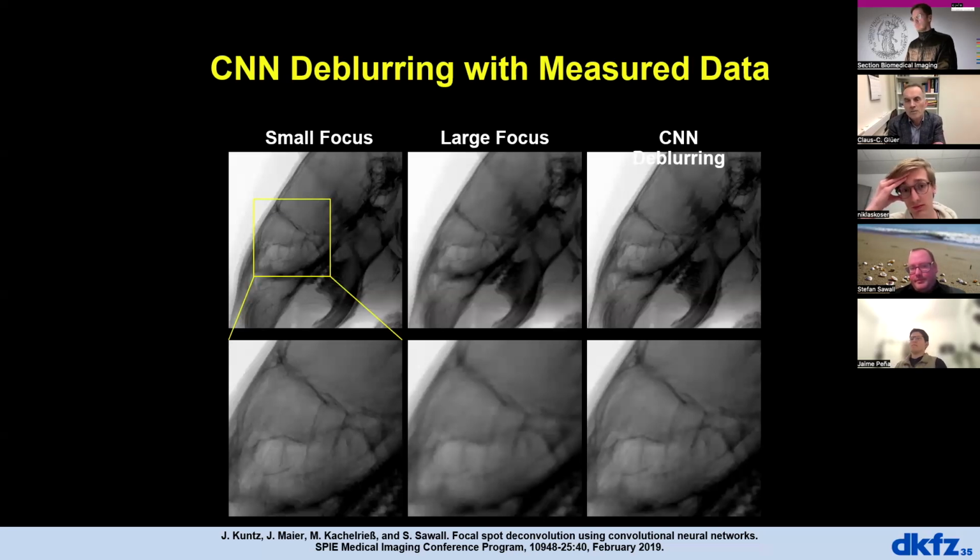And even though it looks different, there may be some information in the training mechanism that would not be apparent to the eye, but may be there. So you might overestimate the ability of AI methods to improve your data. I wonder how you dealt with this issue or whether it's not valid for your setup.